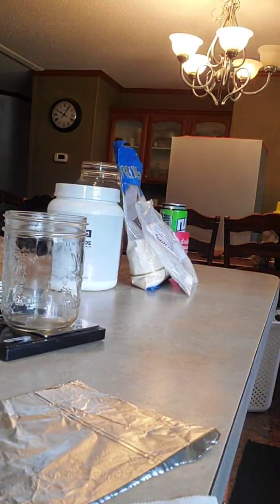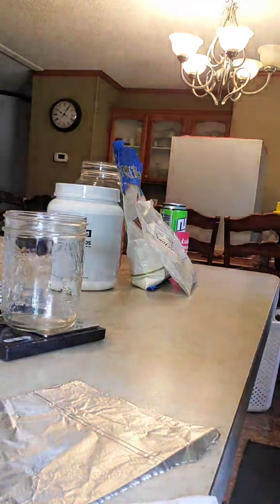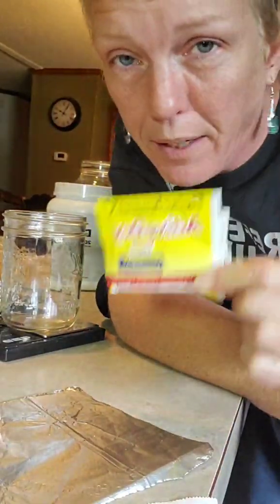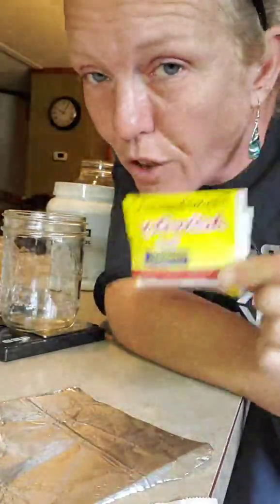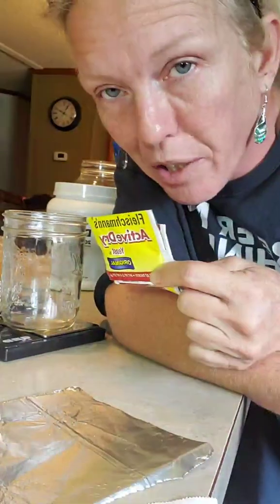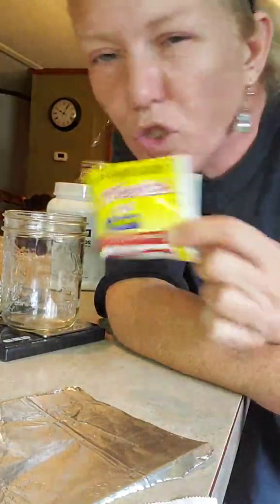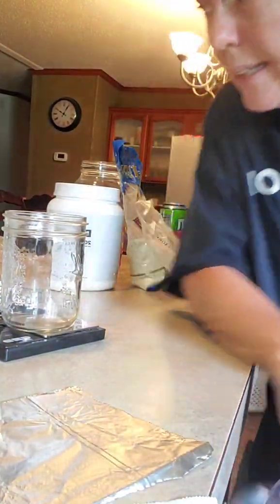When we talk about yeast, I forgot to grab it out, y'all. When we're talking about yeast, we are not talking about what Val uses at work. This is not what you want to use. Do not use active dry or any kind of bread yeast when it comes to your agar. Doesn't work. Well, it works, but just don't use this. Okay, so what we do use, though, is nutritional yeast.